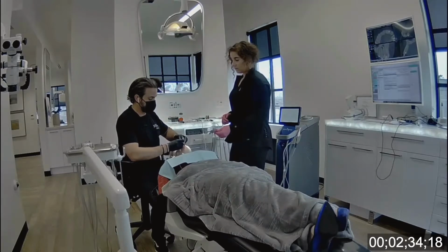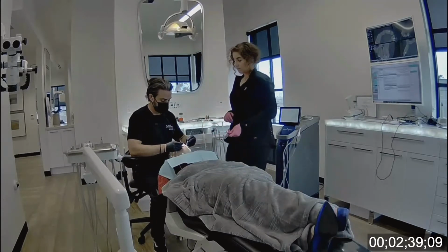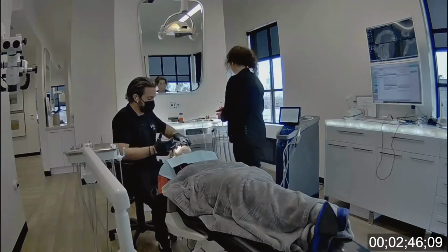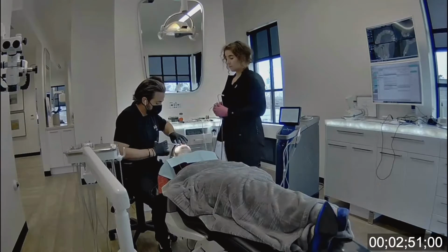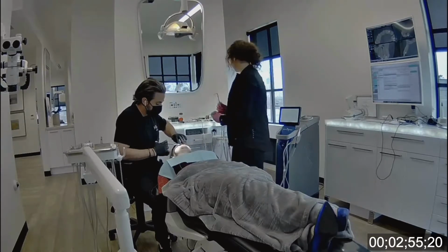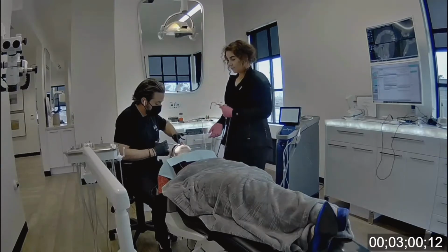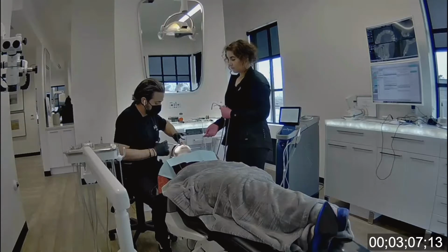Let me see a mirror, please. All right. Okay, bite down. All right, easy does it. So we all know under the nose is a little bit tender.